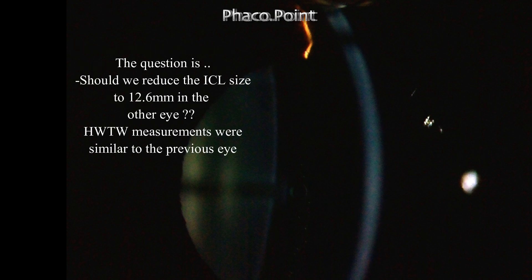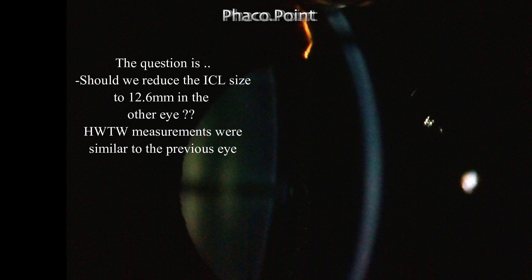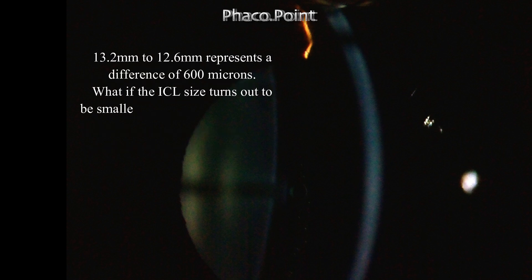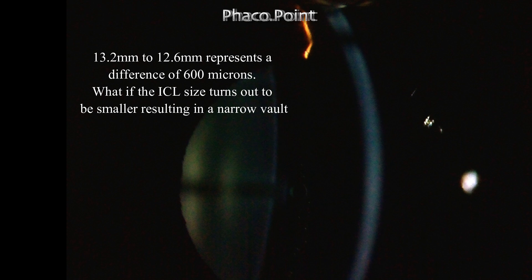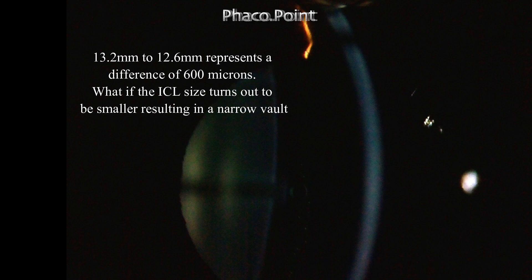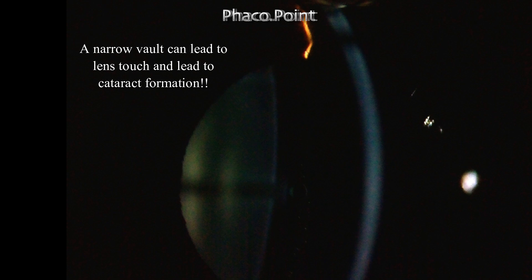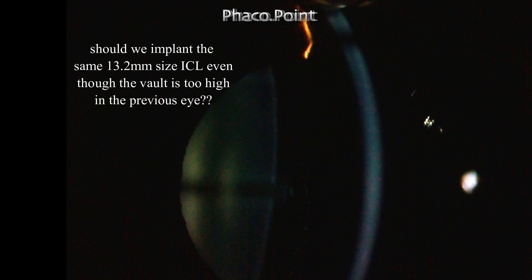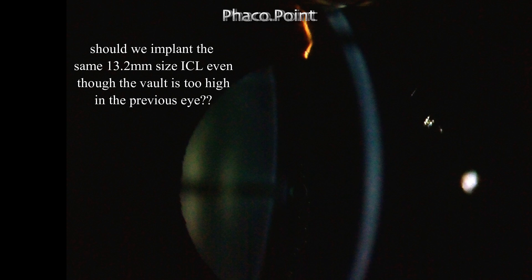The question is: should we reduce the ICL size to 12.6 millimeters in the other eye, since horizontal white-to-white measurements were almost similar in both eyes? Now, 13.2 to 12.6 millimeters — one step below — is a difference of 600 microns. But if the ICL turns out to be too small, will it cause a very narrow vault and cataractogenesis? If the ICL inadvertently touches the lens, it can cause cataract. Should we implant the same 13.2 millimeter ICL in the other eye even though we know the vault is high?